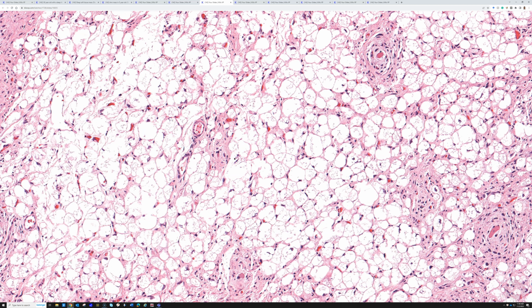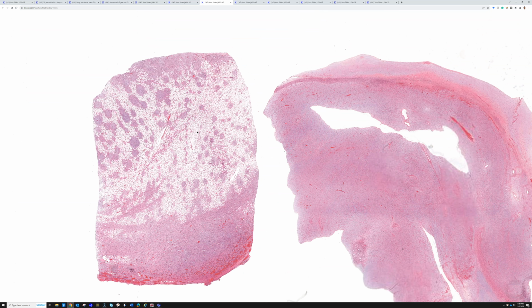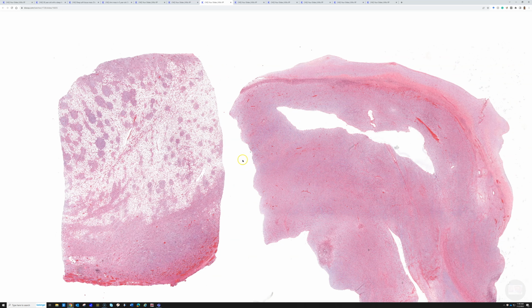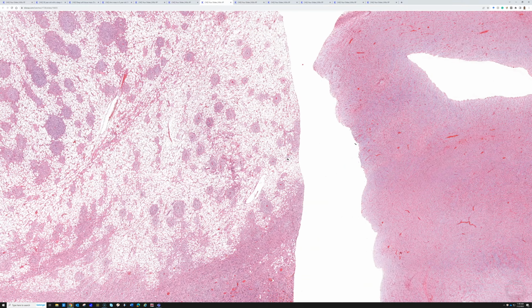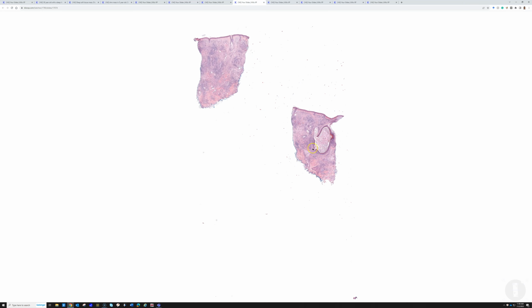So just enjoy all these morphologic patterns for the sake of their interesting nature, but also remember that any sort of tumor you see in the retroperitoneum, always keep dedifferentiated liposarcoma in your differential diagnosis. And if you're having difficulty, you can do testing for MDM2. I prefer using FISH, but some people use immunohistochemistry. Just be careful that you can have false positive staining with immunostains. So you can use molecular testing for MDM2 amplification to help support the diagnosis on a small needle biopsy or in difficult cases. All right.